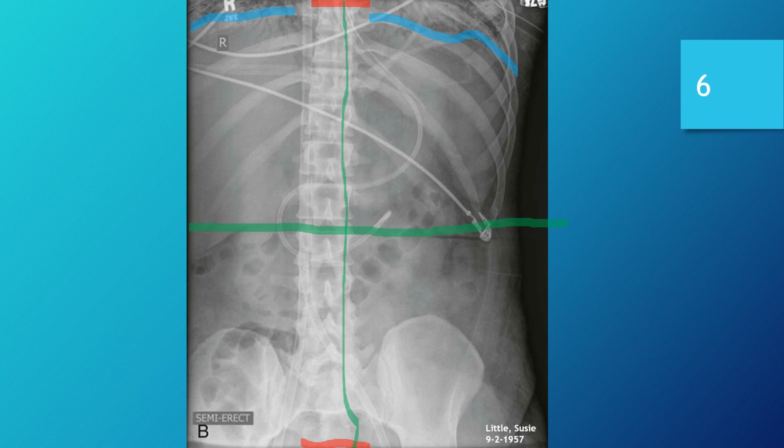So the technologist should definitely return to the patient and adjust the patient to be aligned in the mid-sagittal plane to the image receptor, and make a decision if they're going to make this image upright or supine oriented, and then center the image receptor inferior superiorly according to the landmarks for that exam. So they need to make a choice there, and those are the corrective actions to do so.